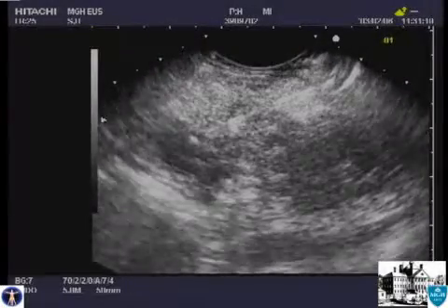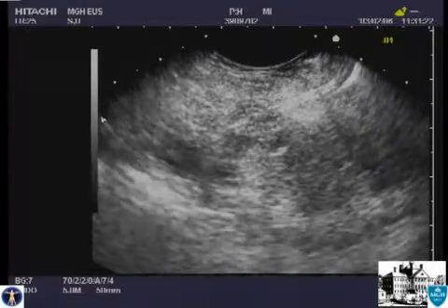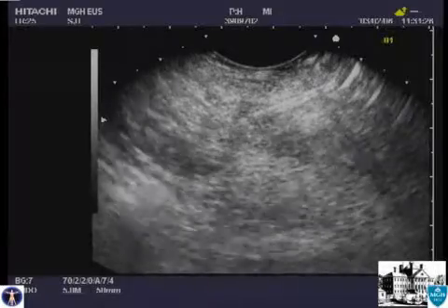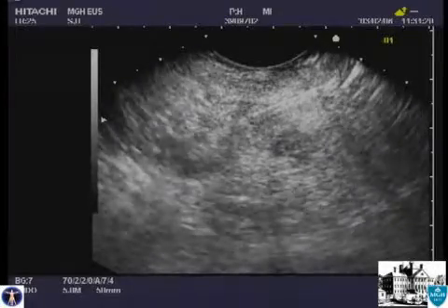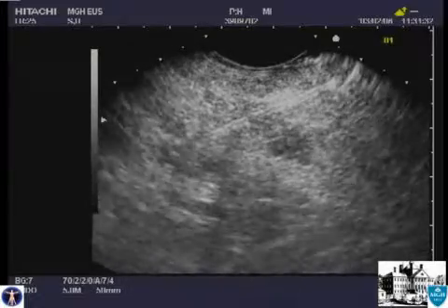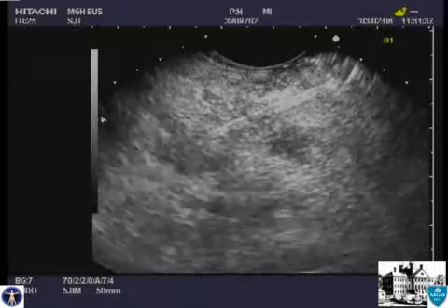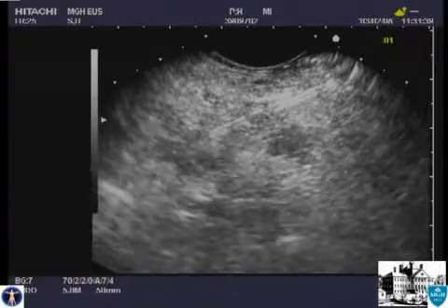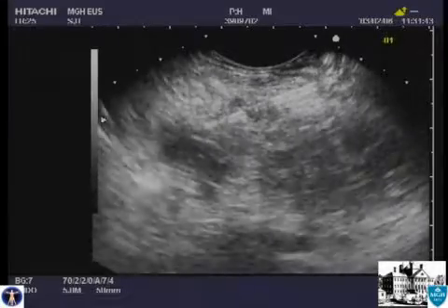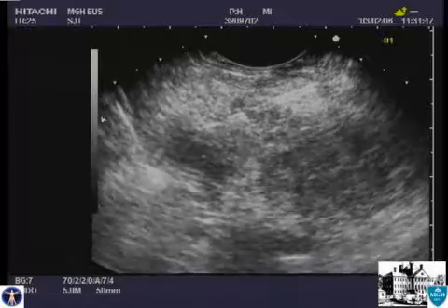Fine needle aspiration is easily performed with a 22-gauge needle through the duodenum. The needle is placed into one locule in order to aspirate fluid for cyst fluid analysis. Usually one passage of a needle is all that is required for sufficient fluid aspiration and cytologic material. In this example, the fluid should be non-viscous and fairly easily aspirated into the 22 or 25-gauge needle.